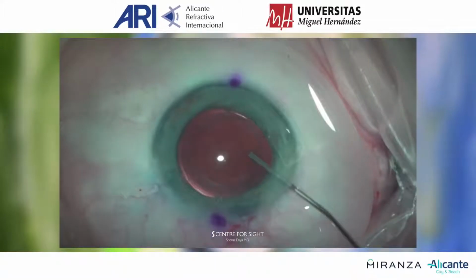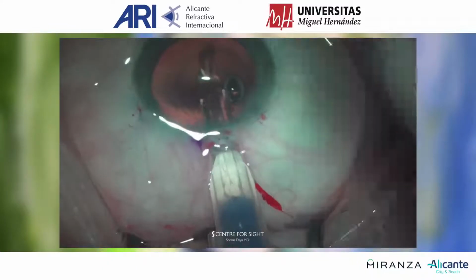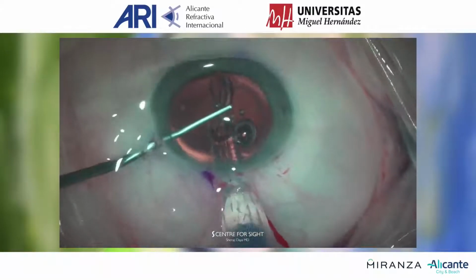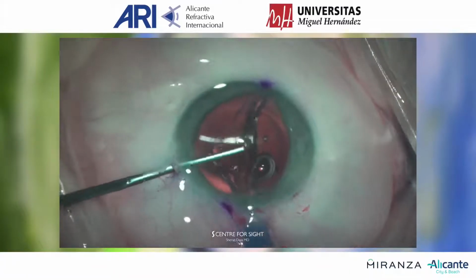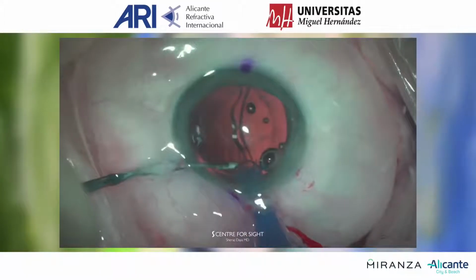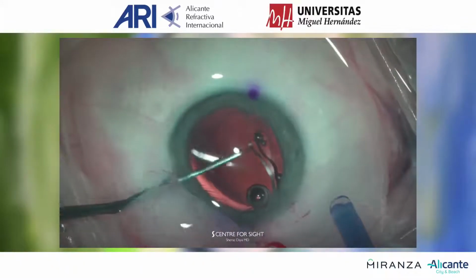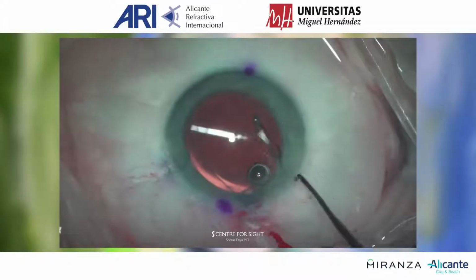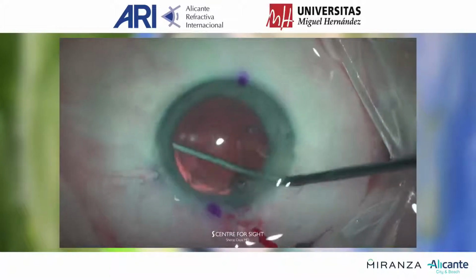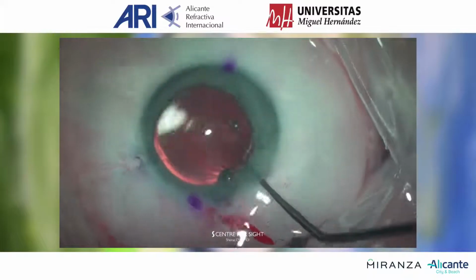More viscoelastic is injected into the sulcus now for the next lens, which is a Sulcoflex lens made by Rayner, and it's a plano trifocal piggyback lens. This is a very large lens and can be quite clumsy to put in. It's got extremely long haptics, and you see it's taking great care to make sure this stays in the sulcus, and those big long arm haptics can be quite challenging to manipulate and implant under the iris.